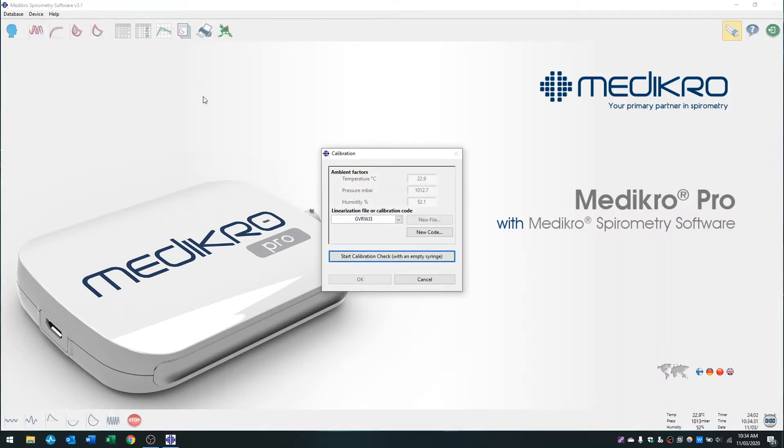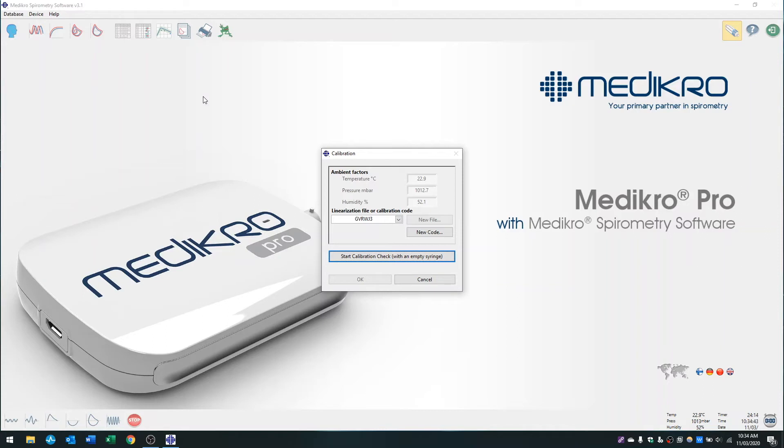If you've just received a new box of mouthpieces, you'll need to enter a new calibration code. The calibration code can be found on the front top of each box of mouthpieces or on each individual packet that is wrapping the mouthpiece under the word code.